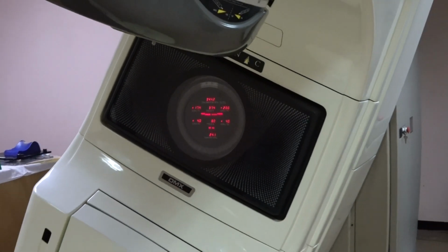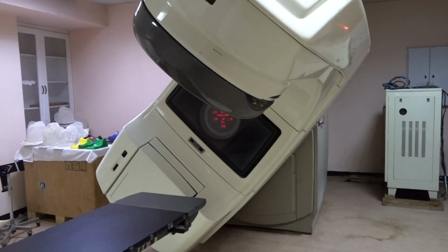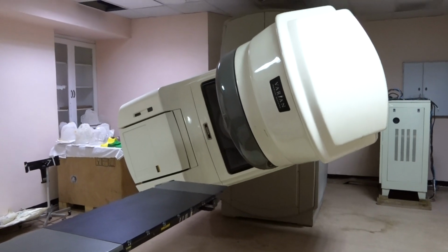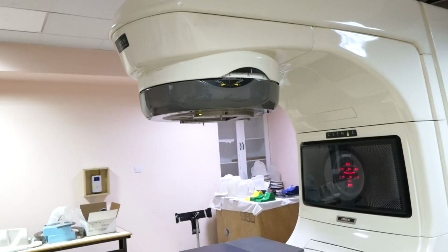After the mapping process, we then call in the patient for treatment. But before we give the treatment, we want to verify, to make sure that the treatment plan that we have created virtually is replicated on the patient. So the patient will come in for a session where we align them, making them lie in the treatment position they were in when we simulated, and then we match the images that we used for planning with the current images that we take when the patient is lying in their treatment position. When we are happy that these two have aligned, then we start our treatment.